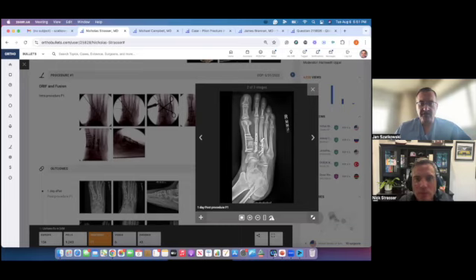Yeah, what I've done too, I've gone several times now, I put a retrograde Lisfranc screw here. Yes, that's what I do on all my. So you're going from lateral to medial, right? Yeah, lateral to medial retro. It's just easier for me because, like you said, you have it all exposed. I have a plate immediately, like you put here, so there's nothing there, and I can just put a screw in, and then I can still put a dorsal plate across the second TMT. Yep. And you could argue I should have done that in this case.